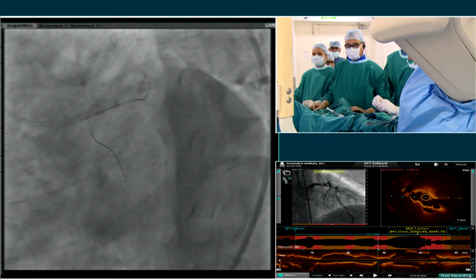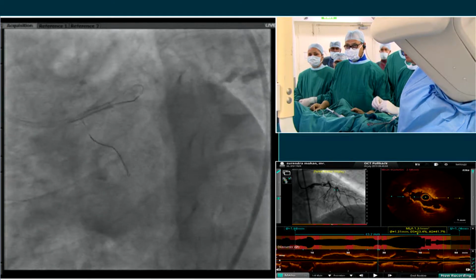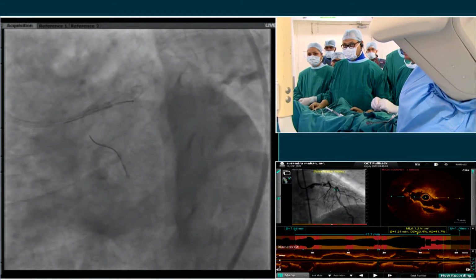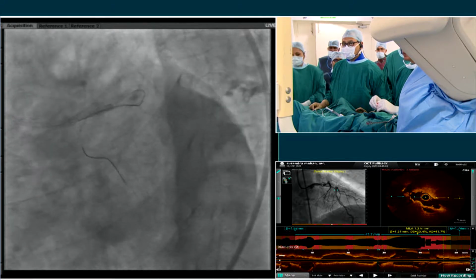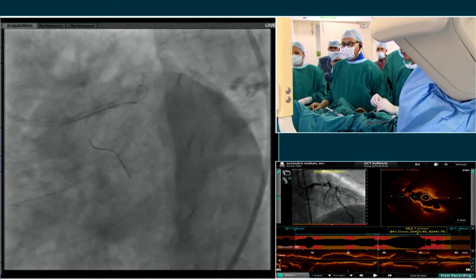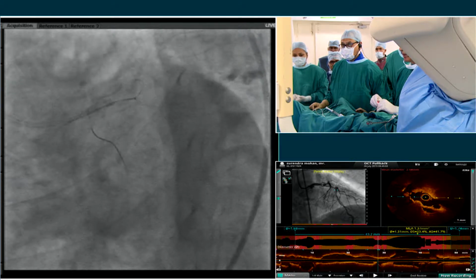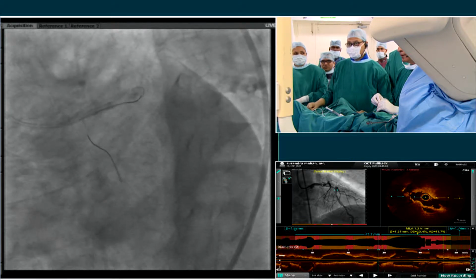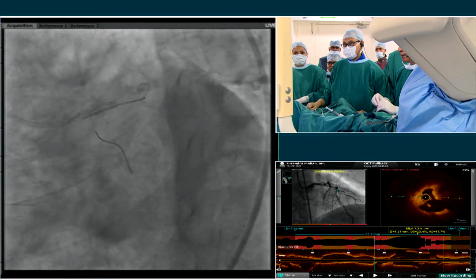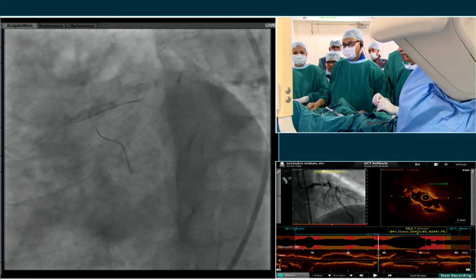We don't have support in place, but we have it on standby. We have kept open the femoral artery. IVP is there. We have a femoral line on the left side also. Oh, so you did. You took a safety line on the other side. We could probably debate for a very long time.